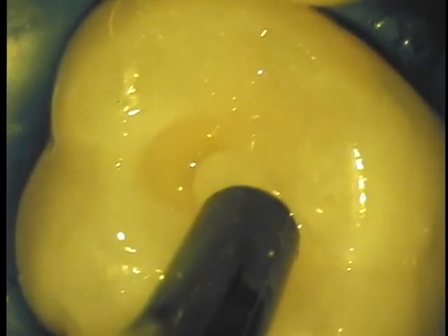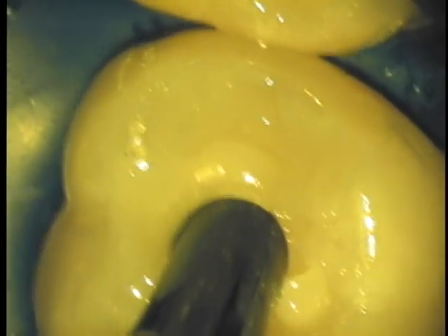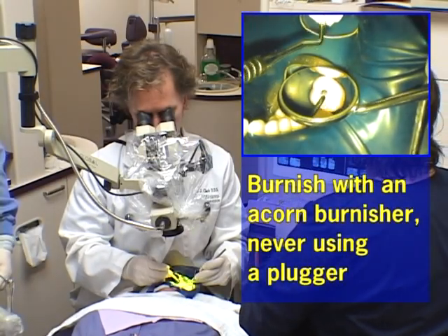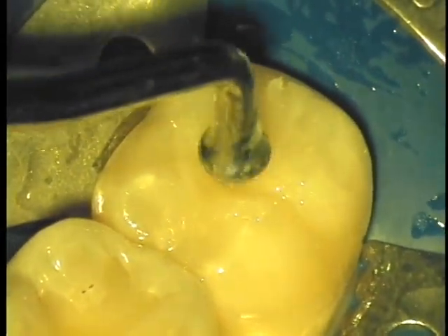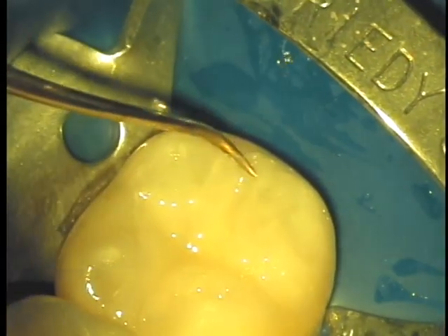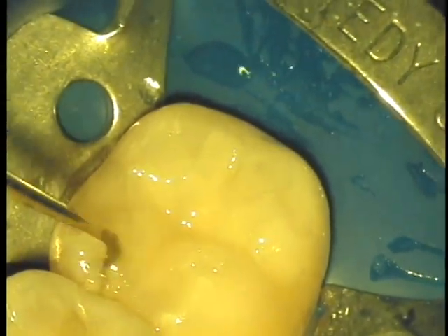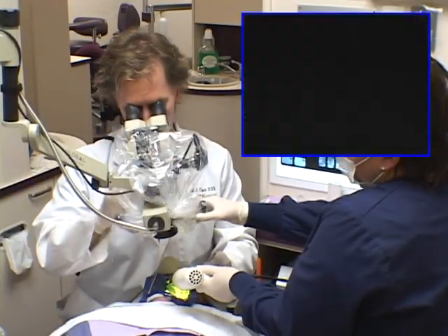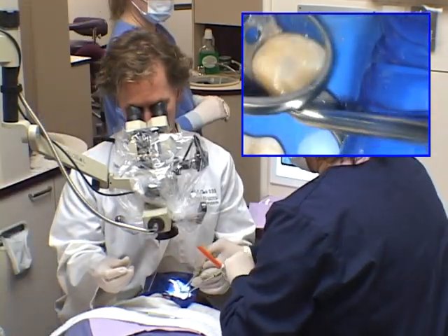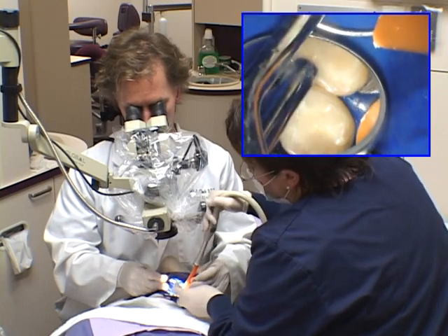The lightly filled resin — in this case Optibond Solo Plus — is placed between layers to help avoid gaps. It is important to not let it remain as a large reservoir; it is there simply to facilitate the marriage between the flowable composite and the paste composite. There is definitely an art to massaging paste composite to avoid tug-back and voids. We want to lubricate the burnisher with resin, never using a condenser like we did with amalgam, and then burnish the paste toward the margins. I don't create exotic anatomy because the longer I play with the paste composite, the higher the odds that it will begin to polymerize prematurely and leave a chalky finish and marginal gaps. I'll carve nice anatomy later with the fissurotomy burrs.